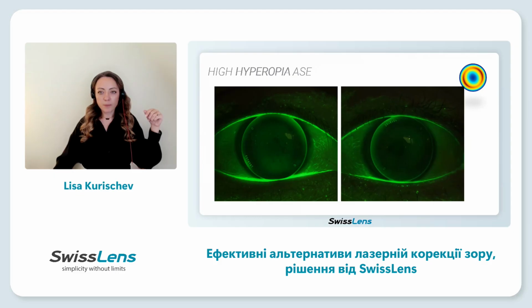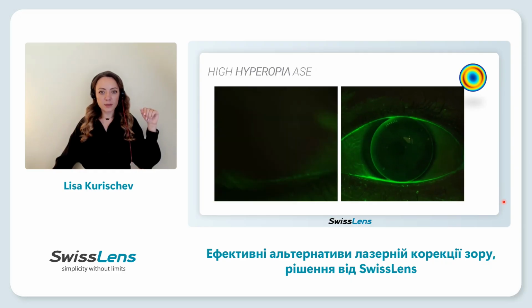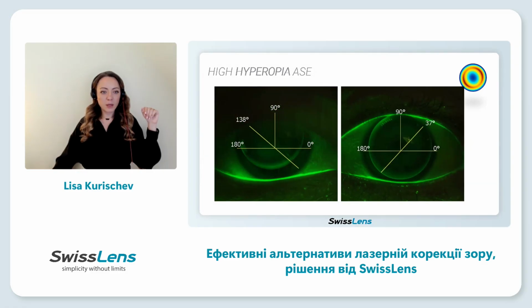And here we are. The first lens we calculated, you can see, sat perfectly centered. And we have a nice movement and it was comfortable. But what is also important for toric contact lenses? It's a good stabilization. Here you can see the fit is stable.